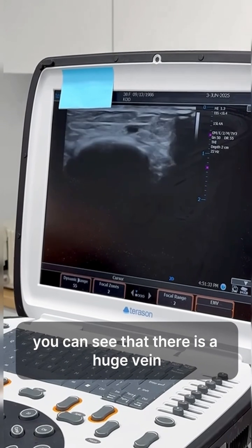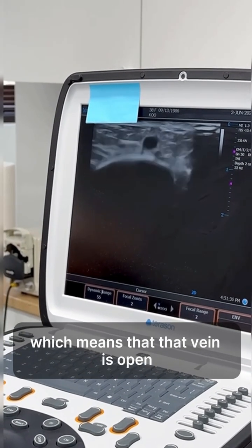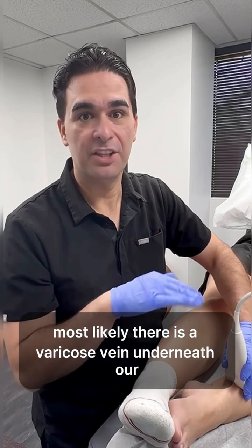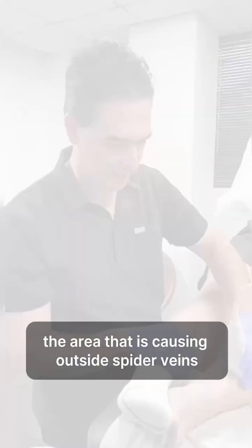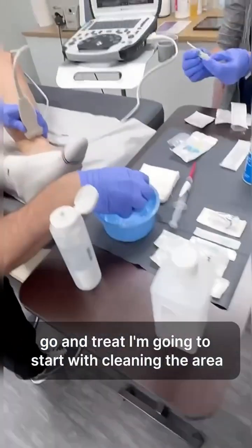...that there is a huge vein. When I press it, it gets closed, which means that vein is open. When we have spider veins, most likely there is a varicose vein underneath the area that is causing the outside spider veins. Let's go ahead and treat — I'm going to start with cleaning the area.